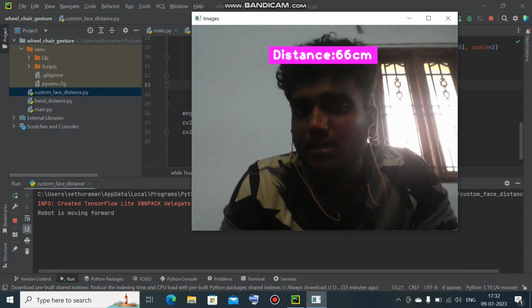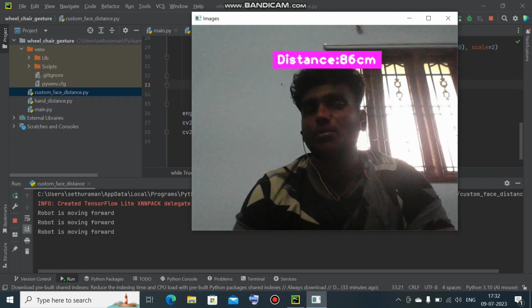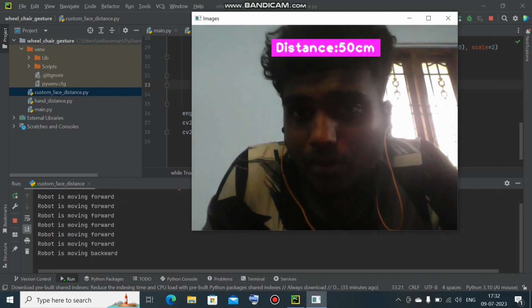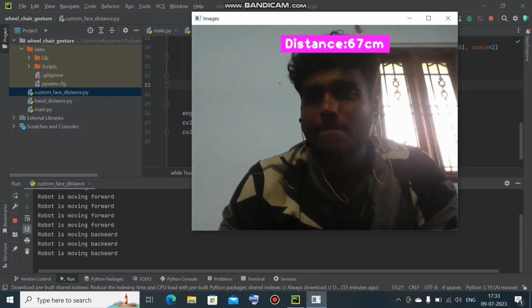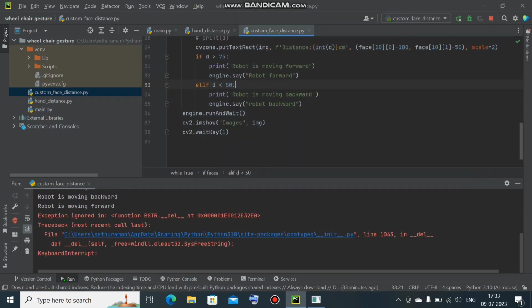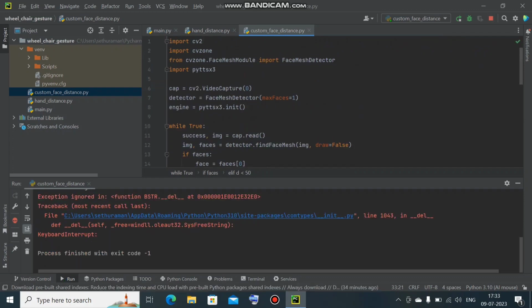If I get the distance greater than 75, you can check here, robot is moving forward, and it is saying robot forward. When my distance is lesser than 50, it is saying robot is backward. So this is how you can make something autonomous using distance. So thank you.